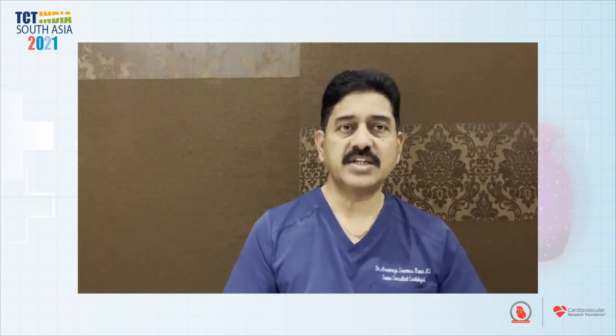After the wire was crossed and balloon dilatation was done, IVUS didn't show too many dissections. Then the concept of treating this with only drug-eluting balloons was brought in by Dr. Ferenc, who was moderating the case along with Dr. Ajay. We all discussed and felt that as of now, what we use drug-eluting balloons for is basically distal vessels, thin vessels, diffuse disease and probably in-stent restenosis.